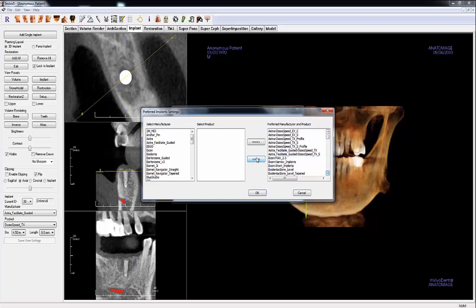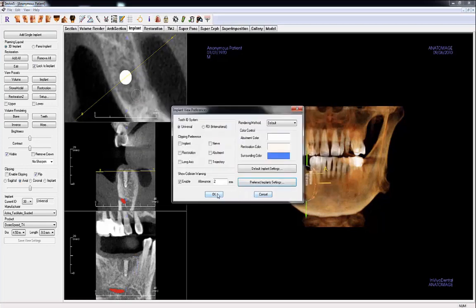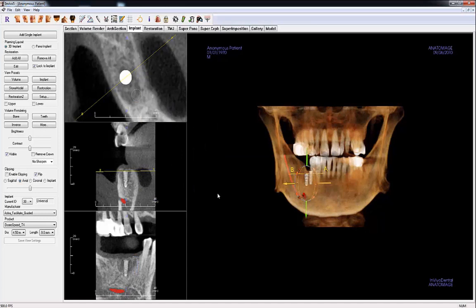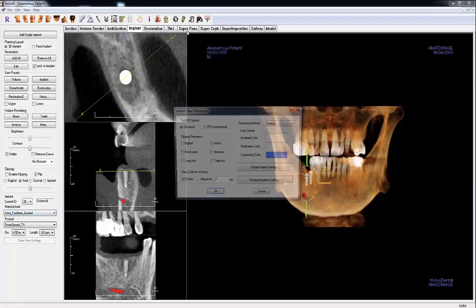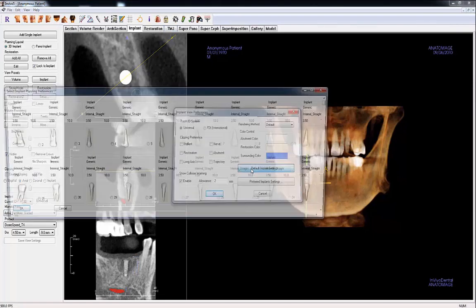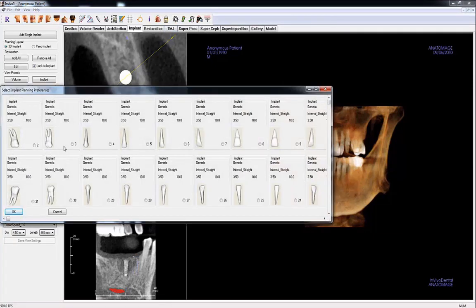During implant planning, if you don't see a certain product or diameter for an implant in the drop-down menu, please switch to the guided version of the implant. If you only use one implant type, click Preferences, then Default Implant Settings to assign default options for each implant number. When you add an implant, it will automatically be set in the drop-down menu.